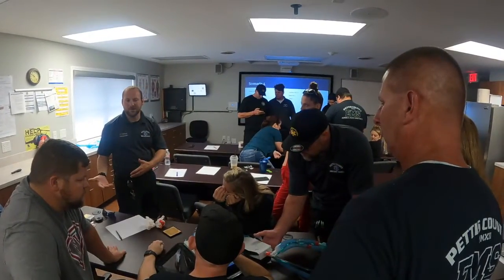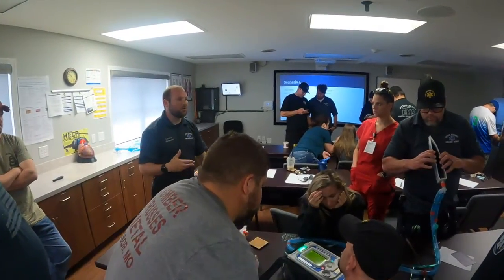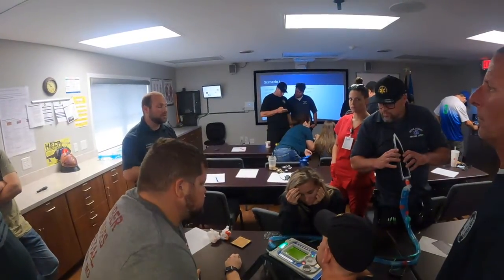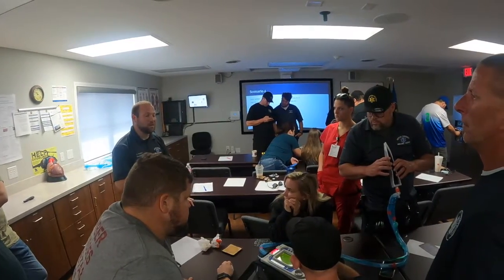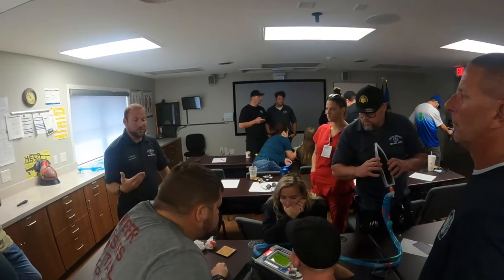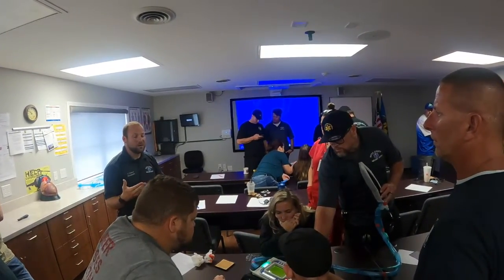If they have respiratory drive and good sedation, but they've still got respiratory drive, SIMV is fine. But if you need to increase sedation, or you have an ARDS patient where you've done all you can and you just cannot get them to comply with the vent, do a long-term paralytic, switch to AC mode, and then worry more about those pressures.